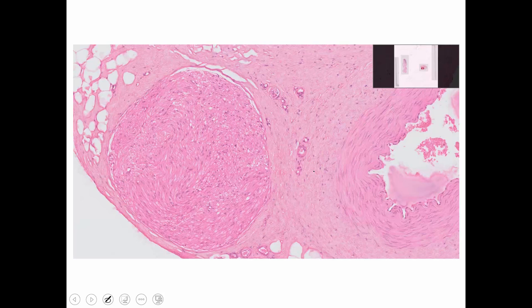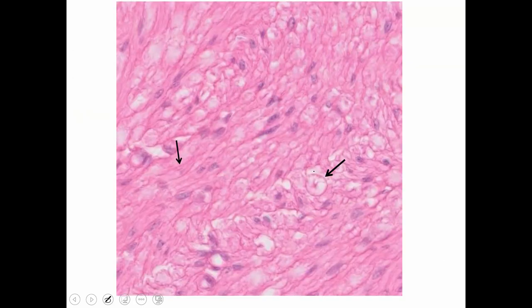Here we have, basically, here is the profile of the blood vessel. And this is actually a profile of nerve. And when you look at that, you'll hear that nerve represents cut axons. And this is a bundle of cut axons. And if we focus on this, again, the axons could be, it's wavy. So when you do a section of it, you may get a circular profile. This is the axon inside, myelin sheath outside. Or this is the area of longitudinal cut of axons. Okay? So again, appreciate that you may be looking at longitudinal cross sections from different perspectives.